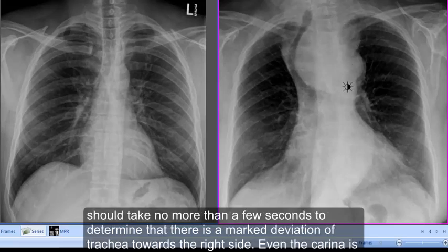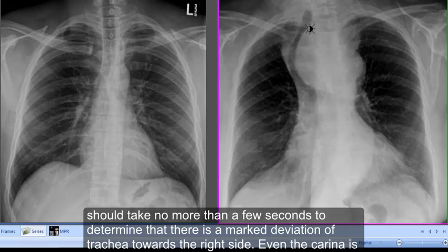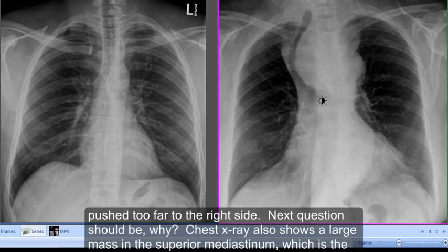Looking at the x-ray on your right hand side, you should take no more than a few seconds to determine that there is a marked deviation of the trachea towards the right side. Even the carina is pushed too far to the right side. The next question should be: why?